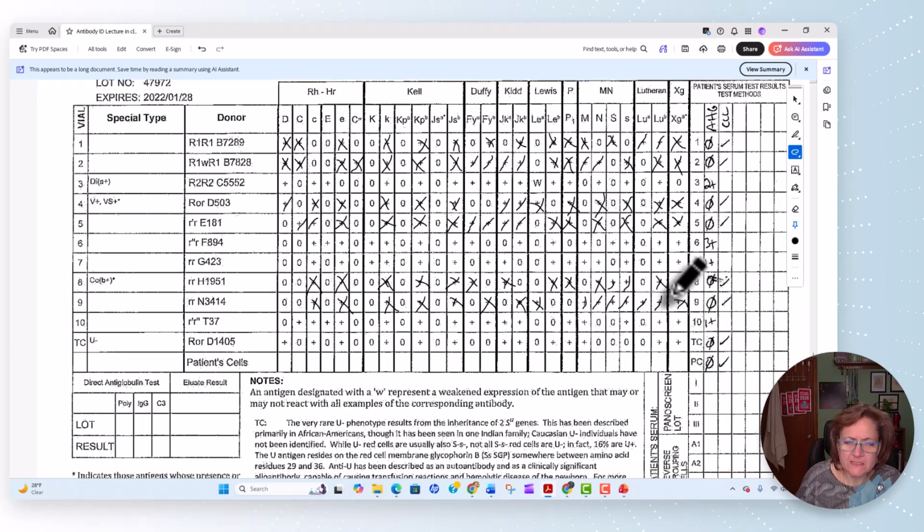Last one here, my tech cell, which is my cell 11. It's a heterozygous D. I had a question earlier today: yes, these change every month. You're going to get a different panel, and when you do, these will be different donors. These donors only donate once every few months.